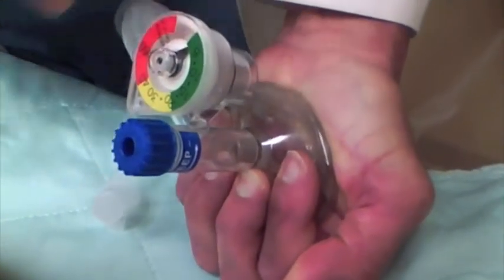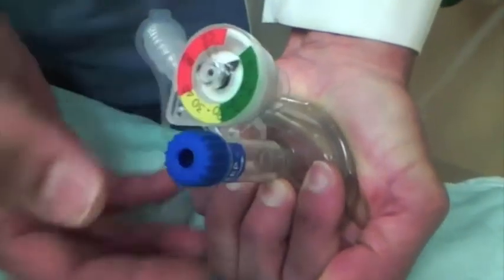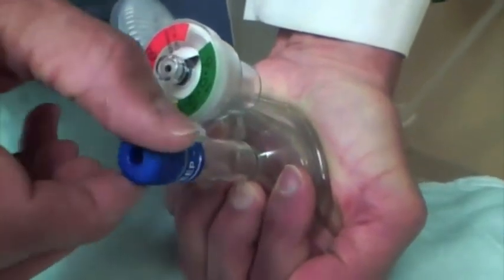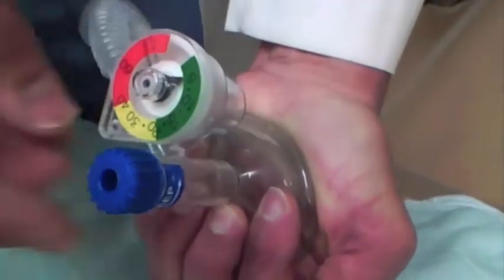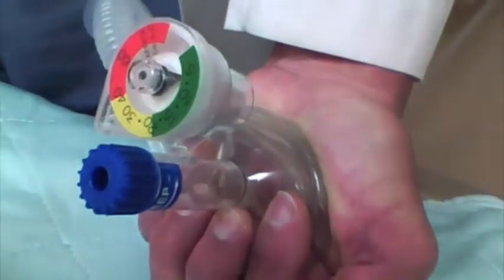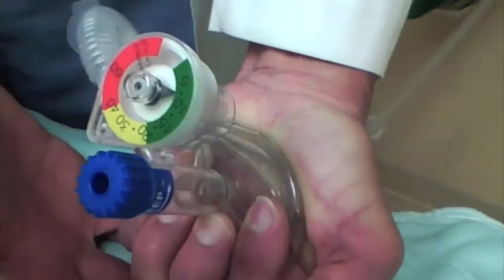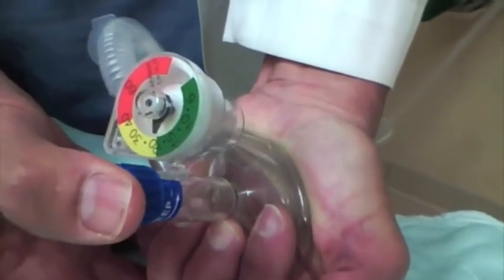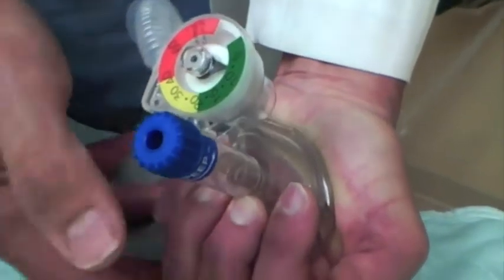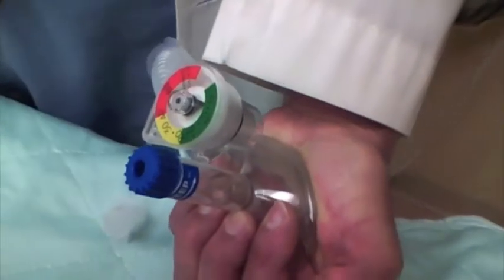You notice we're going down to zero. Suppose I want to add a little bit of PEEP — I start to turn this in. Turn it up a little bit more and now you can see I'm beginning to deliver some PEEP. Turn this up a little bit more and I've got five of PEEP. So now I'm ventilating this child with about 25 centimeters of water and five of PEEP. Each time I put my thumb on here I'm going to deliver 25 centimeters of water; when I take it off I'm going to have about five of PEEP. I can dial this down if I think it's too much, and I'm going to use blood gases and whatnot to manage the rest of it.